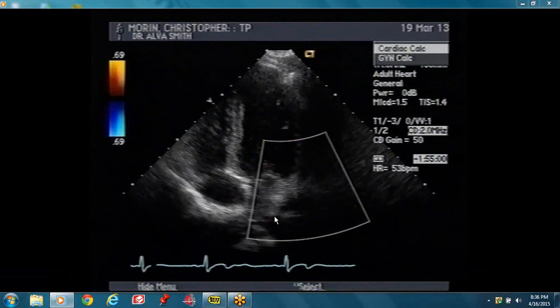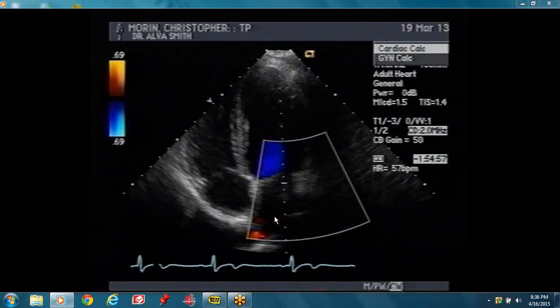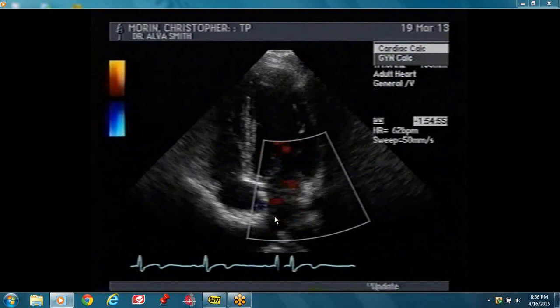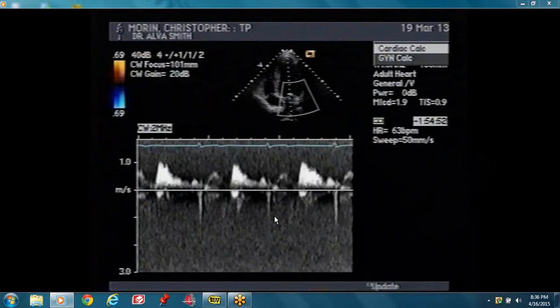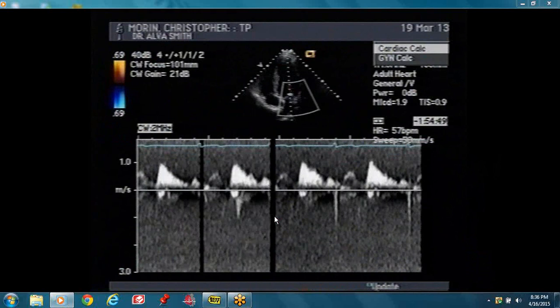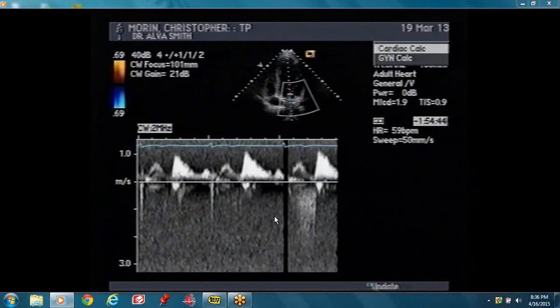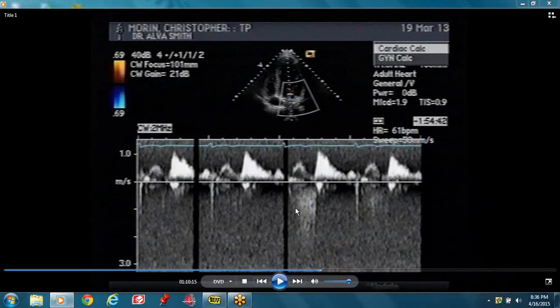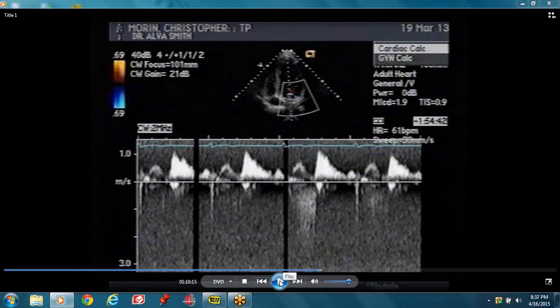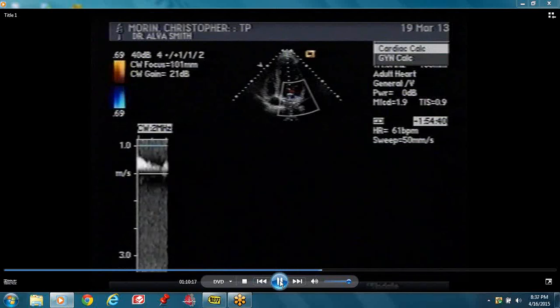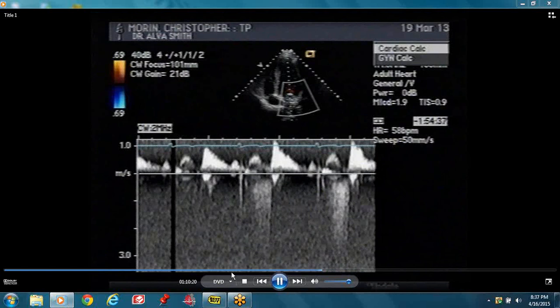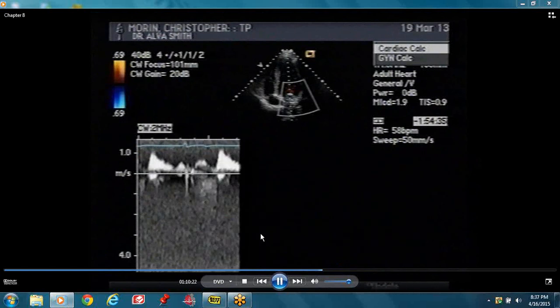Make sure your EKG is present in all your studies. When you have a case where you want to properly assess the regurgitation, you have to move the transducer. She identified a small envelope which is MR, but it's physiologic, so you wouldn't really try to determine the severity of that because it's barely visible.